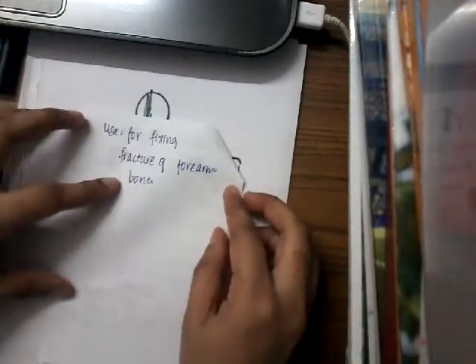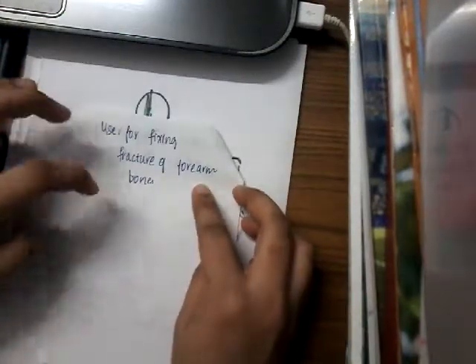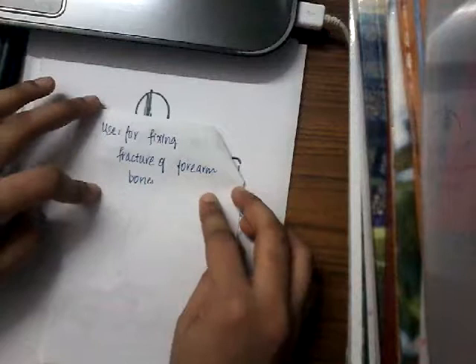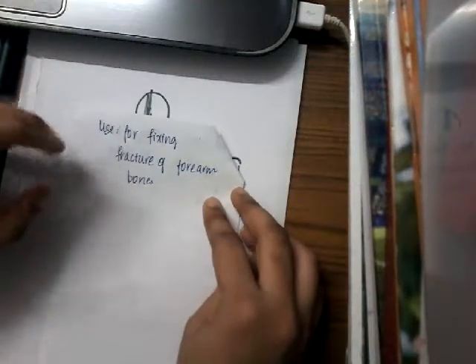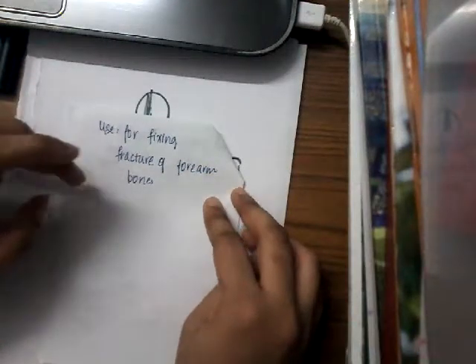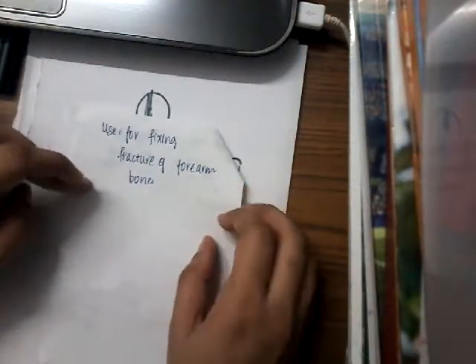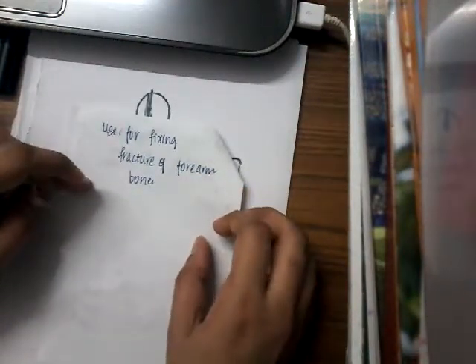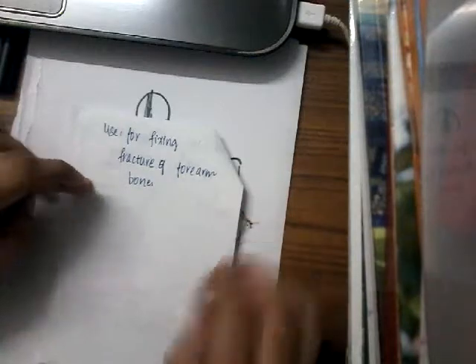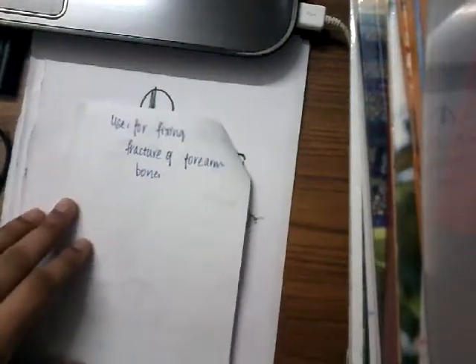What is the use of this Rush nail? It is used mainly to fix forearm bone fractures. Remember it is used to fix forearm bone fractures, either radius or ulna. So this is about Rush nail. Thank you guys.